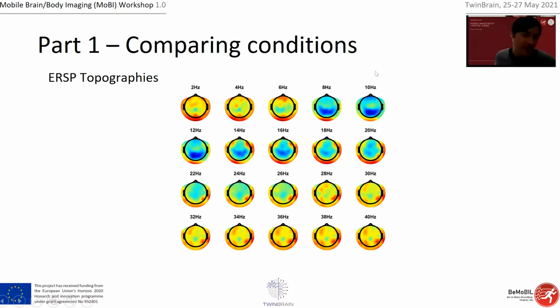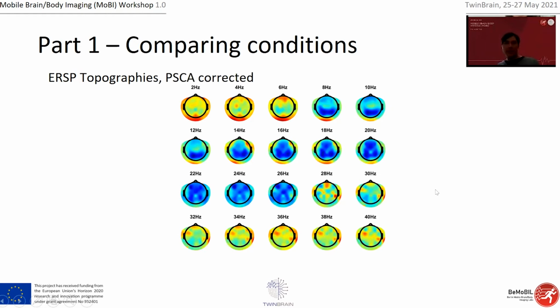What is very nice to see already in this data set, which is your data, is that we saw suppression at around 10 Hertz over visual parietal areas, which is very characteristic. In addition, for beta ranges, there is a second blob coming. This is not yet source analysis, but we still see the phenomenon we're interested in. If you take these uncorrected topographies and split them up as described before, those phenomena get stronger and those other ones vanish.